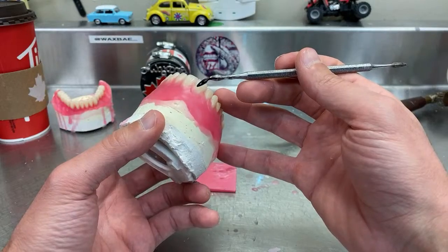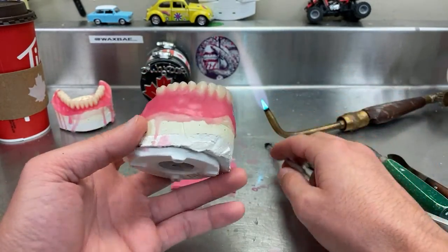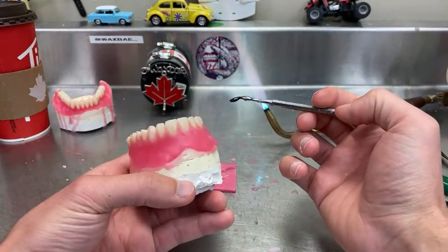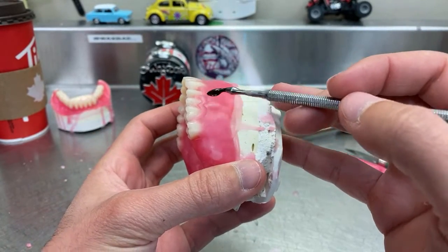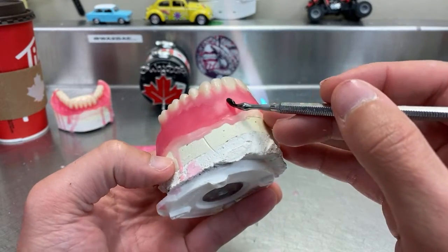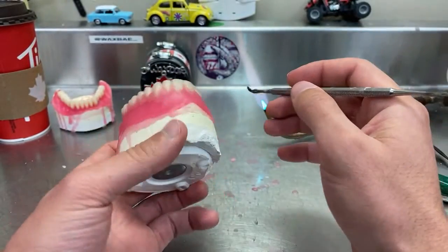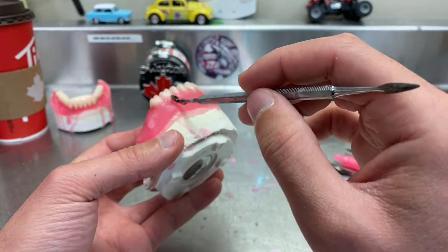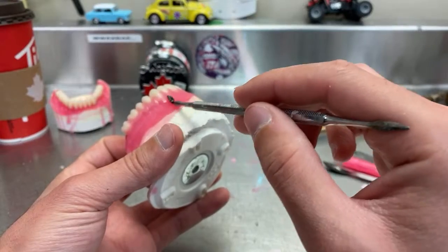So you're talking about the cervical lines. Why am I covering it? Because I'm going to carve it later. Okay, so now another secret here. Where is that tool? Anyway, I'll use anything. You see here what we created. This, you don't want to lose it. These are good because that's what's going to give it that natural look. But also you don't want that line to be very distinct here. I don't know what the word is, but anyway, you don't want it to be showing that bad. So you want to blend it in by heating any tool and just go like this. And as I said, work it just randomly.